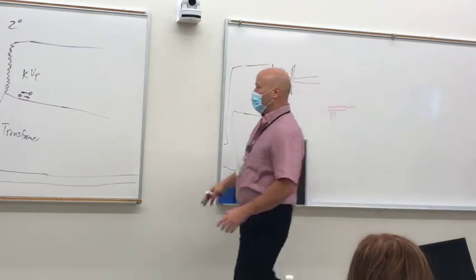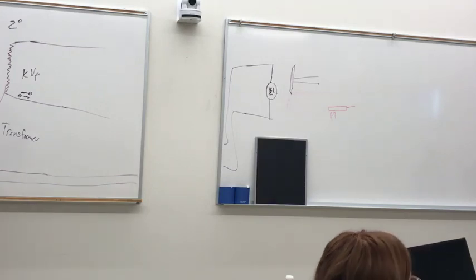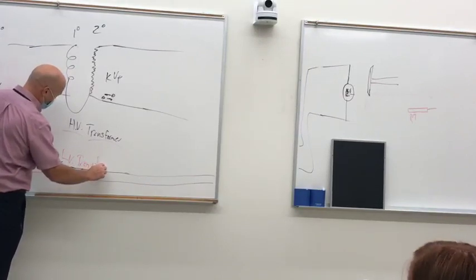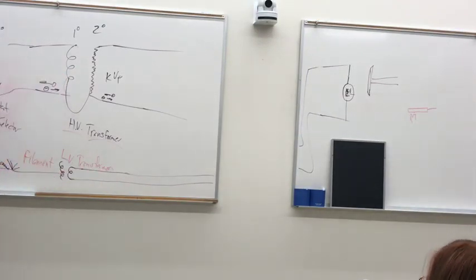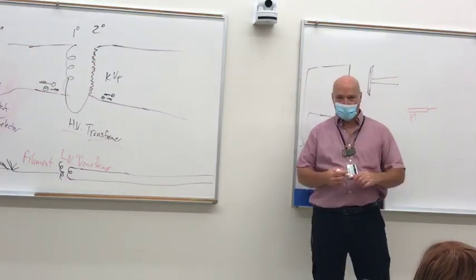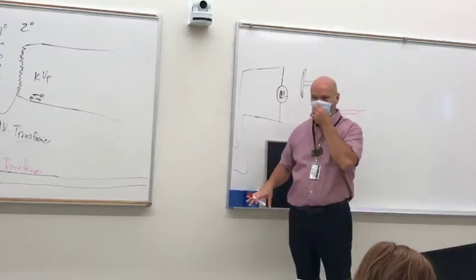All right. So the only thing that we've energized at this point is the filament circuit. So this is a filament circuit. If this is a high voltage transformer, this would be a low voltage transformer. So that's low voltage, the only thing that we've energized so far.